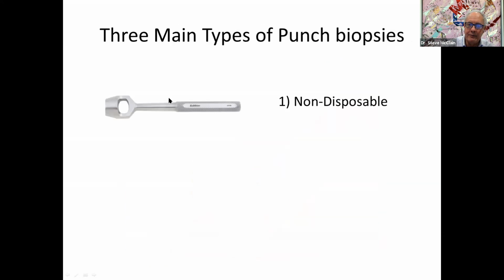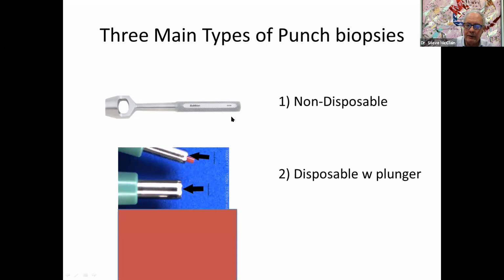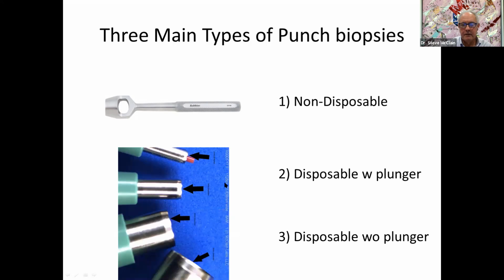Punches are 3 types. There's the ones you can resharpen, and you can go all the way down and get bone if you wanted to with this sharp tool. It comes out the top here. So this is a non-disposable one. There's disposable ones with a plunger, and these are the ones we're going to demonstrate for you today. And then there's the larger ones. They're disposable, but there's no plunger. These disposable ones with a plunger are more expensive. That's about a $4 tool that's in your kit tonight.